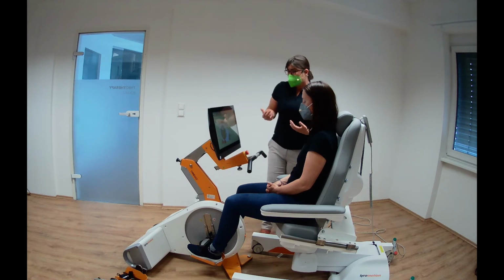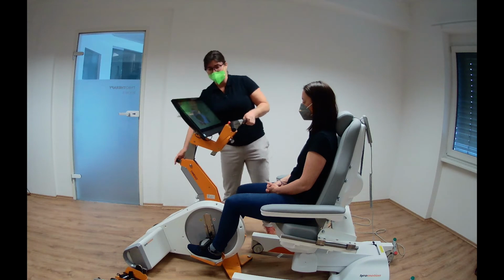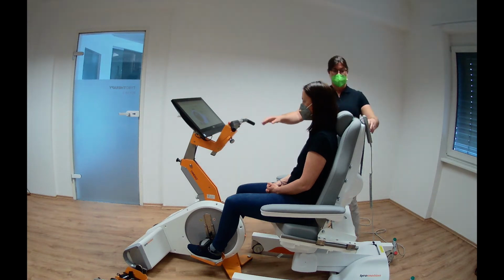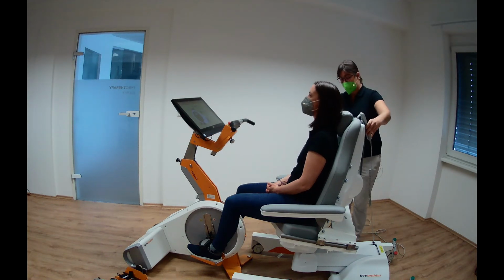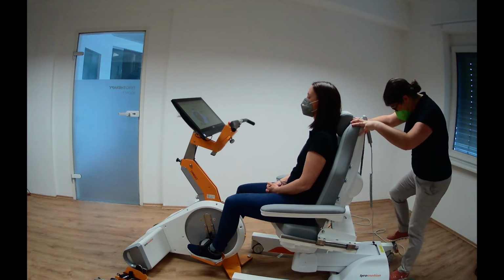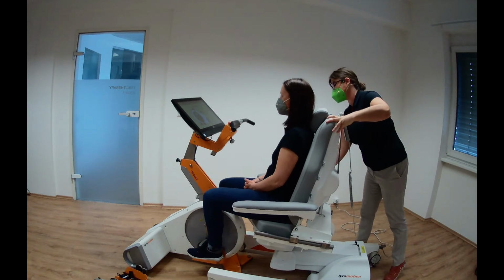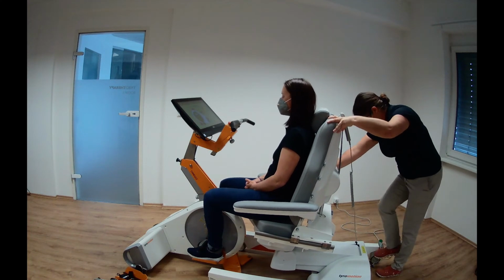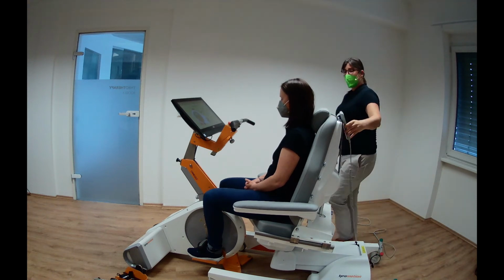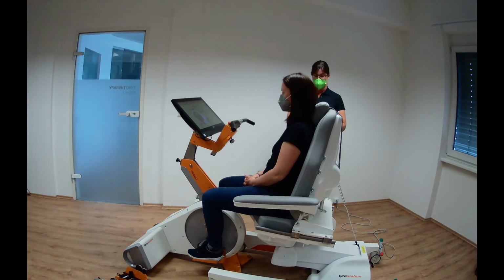To bring Barbara in an almost standing position, we have to lift her up a little bit. And before we do that, I want to bring her a little bit closer so that she is in an almost standing position. As I mentioned before, it always depends on the patient's needs and if she can tolerate it or not.